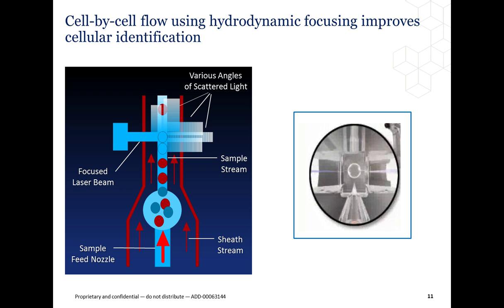This is actually called laminar flow and works in the same context as a laminar flow hood. The two liquids travel at different rates of speed, and they do not intermingle. That's what's called the laminar flow. The special geometry of the flow cell and flow rate of the sheath fluid puts these cells in a single file line.